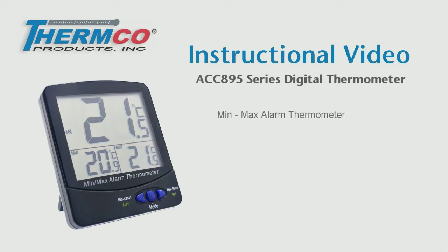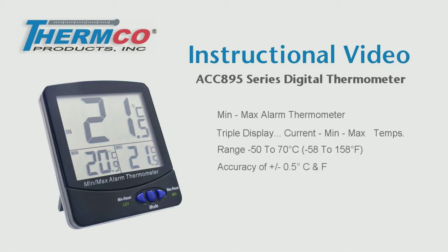This unit is a min-max alarm thermometer with large-digit triple display that simultaneously shows the current, min and max temperatures and has a temperature range of minus 50 to 70 degrees Celsius or minus 58 to 158 degrees Fahrenheit with an accuracy of plus or minus half a degree C and F.